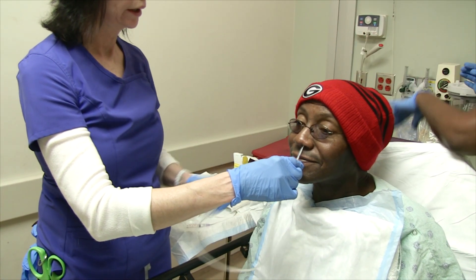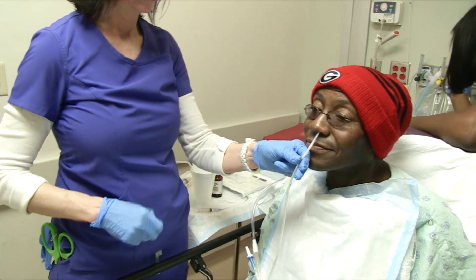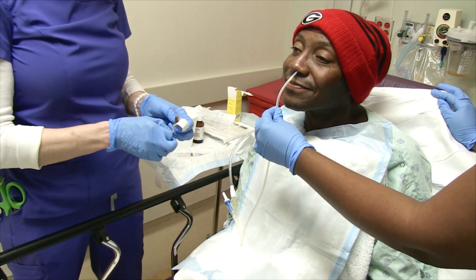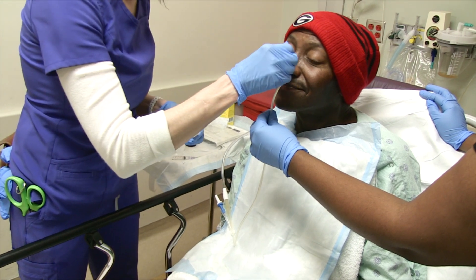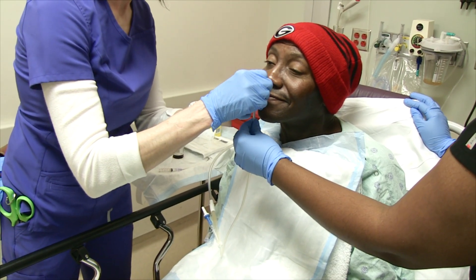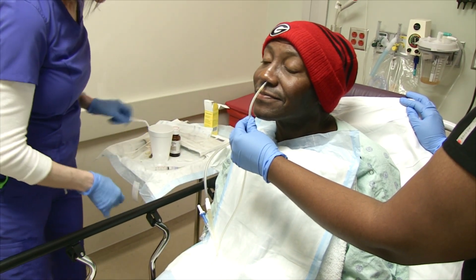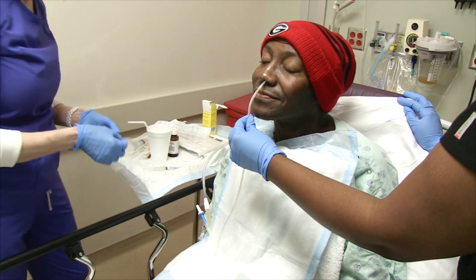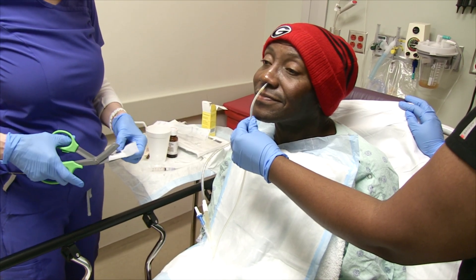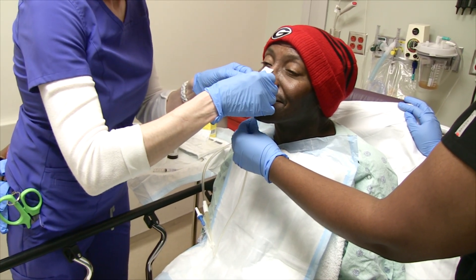I'm not going to let this pull on him. I'm going to take it to his gown. I'm going to use benzoin — sometimes it takes more than two hands. Just a little bit of benzoin. I like to have a hypoallergenic dressing. It's really good to do this before you put the benzoin on, because after you put the benzoin on it sticks to everything.